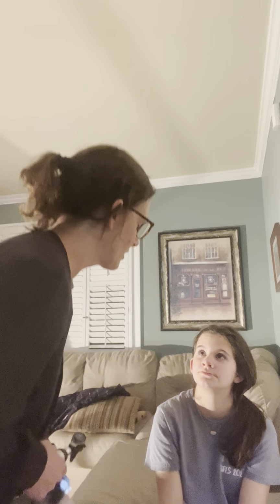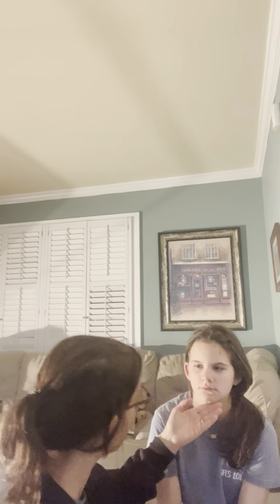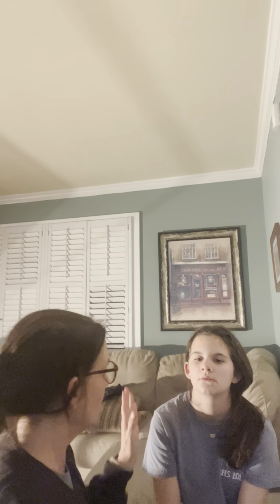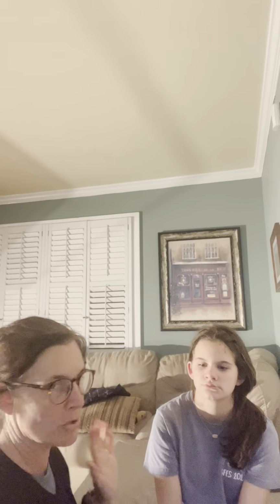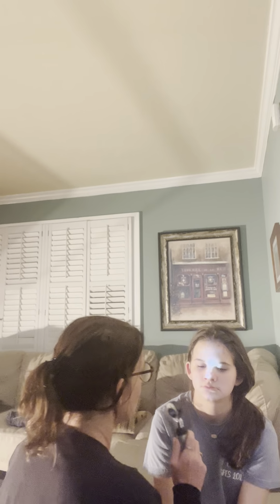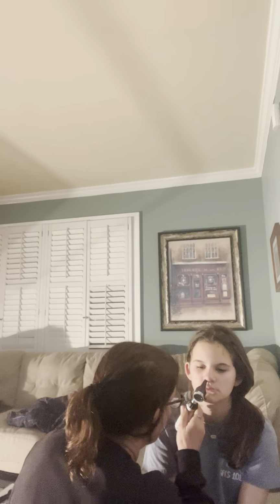But first, I would assess and observe the nose, and I would test and palpate her nose. I would also look and make sure there's no deviated septum. In the normal clinical setting, I would assess both sides of her nose, but for the sake of the video and time, I will only look on one side. So I would insert the scope into her nose, and she did not have much drainage, so I'm able to use the same one.